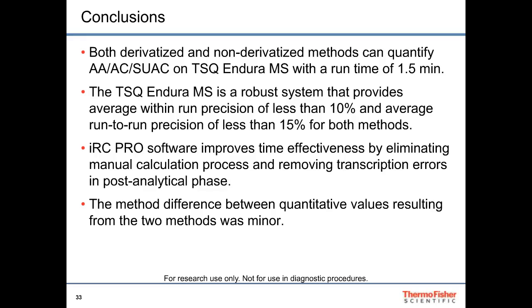But actually, in practice, somebody can use some curve to make some calculation between these ratios of these two analytes, and can still achieve the practical needs. So I could argue that both methods can be used and generate pretty reliable results.